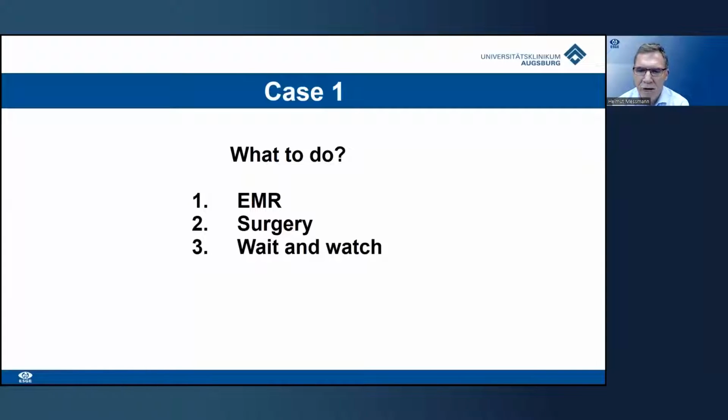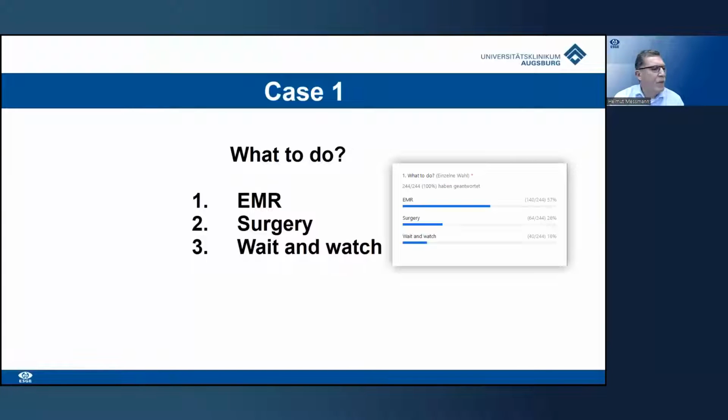Would you go for endoscopic resection? In this case, piecemeal EMR. Would you recommend surgery or wait and watch? And now you can vote. And so there are 57% going for EMR, 26% for surgery, and wait and watch 16%.